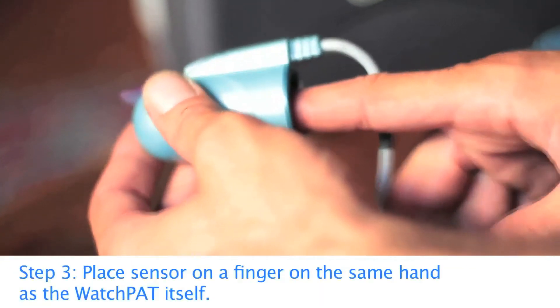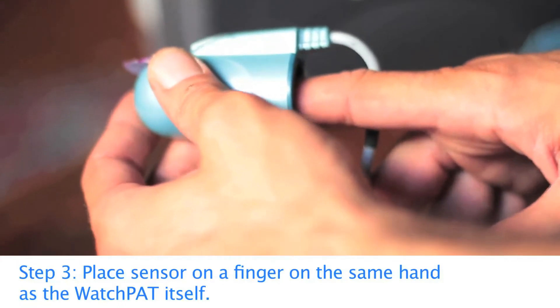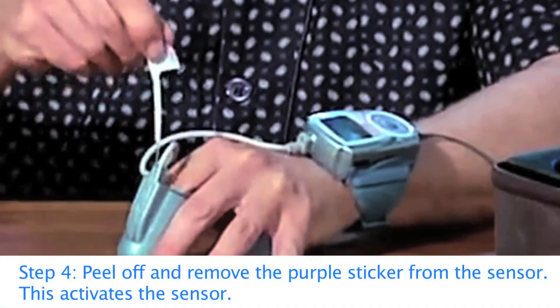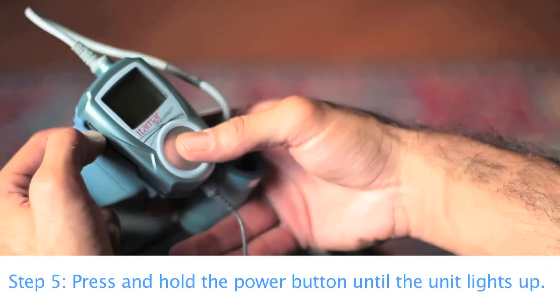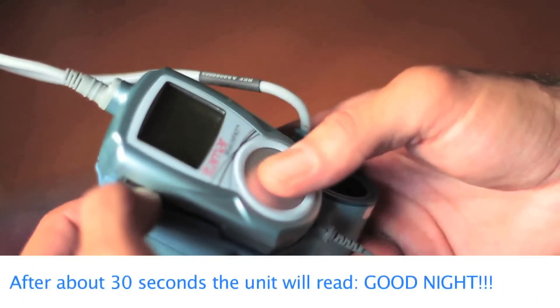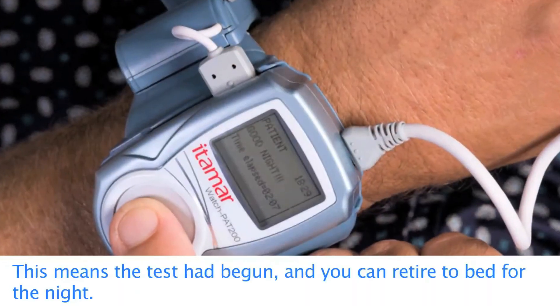Place the sensor on a finger on the same hand as the WatchPat itself. Once the WatchPat device and finger sensor are in place, peel off and remove the purple sticker from the sensor — this activates the sensor. Press and hold the power button until the unit lights up.